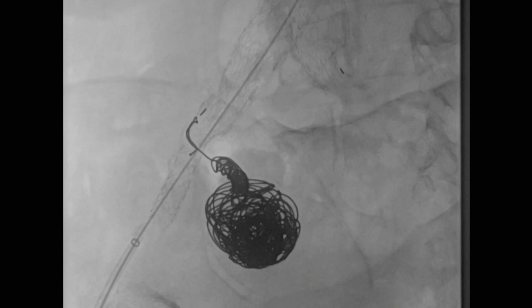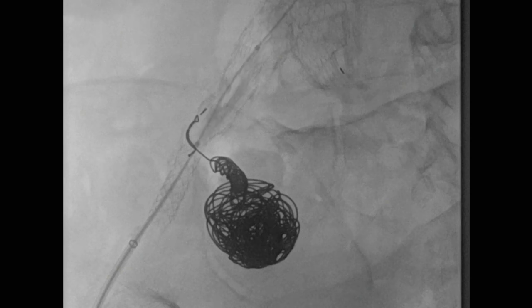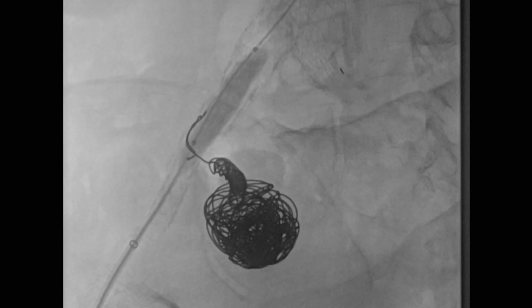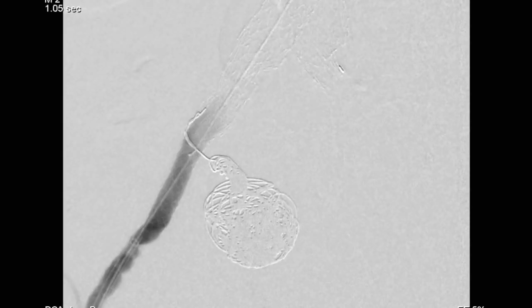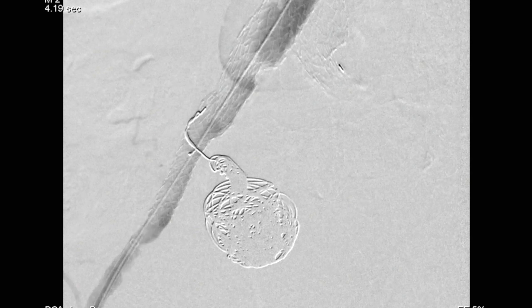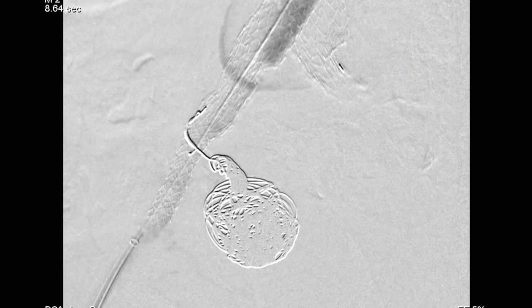It's still distal to the top of the VBX, so at that point the case is over. On follow-up, this was a complete occlusion. This really demonstrates a combination of sealing off the origin with the VBX while embolizing it. There was a little bit of an endoleak alongside the VBX, so we actually took that up to about 8mm, and you can see the whole thing is beautifully sealed off. Thank you very much for your attention.